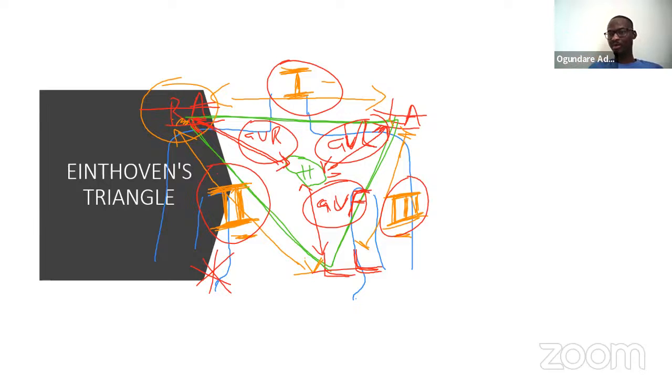These 6 of them plus the 6 chest leads, which is quite simple, the V1 to V6, gives us the standard 12 lead ECG. I hope that makes sense. So this is how we use the 10 electrodes. To be honest, they're actually 9, like I told us. Because we use 3 here and there are 6 chest leads, so it's actually 9 electrodes that we use to generate the 12 lead ECG. I hope that is simple enough.